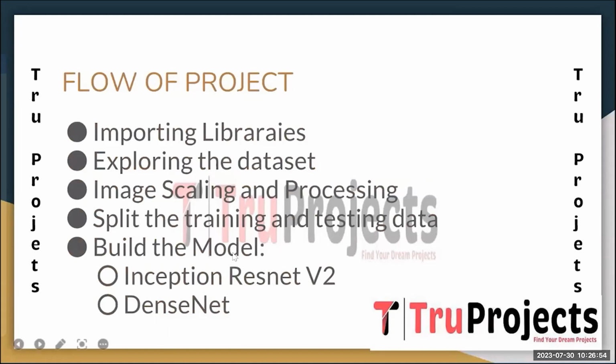And the next step is building the model. In this phase, we build multiple deep learning models, and the first one is Inception ResNet V2. It is an advanced deep learning architecture that combines ideas from the Inception model and ResNet. It is known for its efficiency in extracting complex features from images, making it suitable for tasks like neovascularization detection in fundus images.